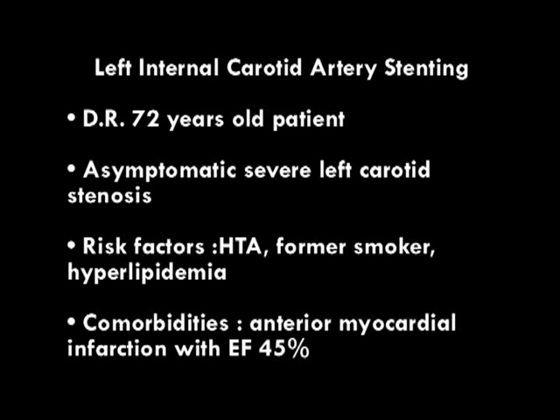Here we have a 72-year-old man with asymptomatic severe left carotid stenosis. He has a history of anterior myocardial infarction with an ejection fraction of 45%. He's hypertensive, hyperlipidemic, and a former smoker. The patient chose the stenting approach.